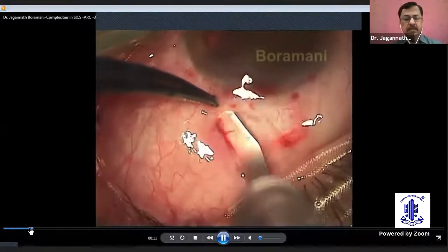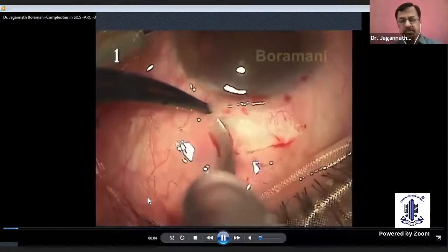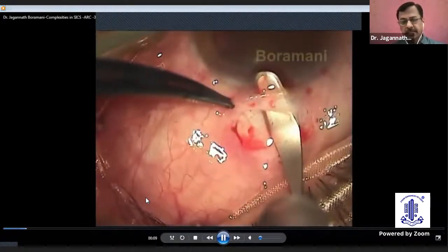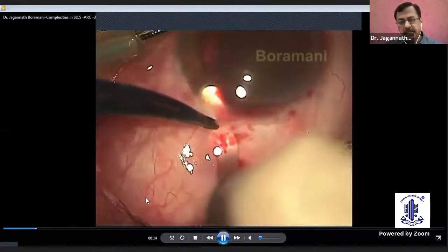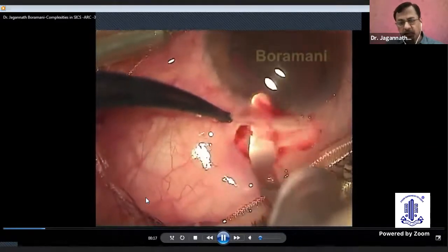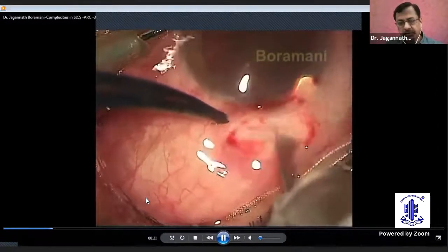Now, basically, if you are not careful when you do the dissection, sometimes there can be scleral buttonholing. Here the scleral buttonholing has taken place. So, every time there is no need to change the site — maybe you start a deeper dissection, go to the left side, and form a new tunnel below the scleral buttonhole site. So you can have a proper tunnel again in the lower area, and this way you can proceed with surgery in such complicated cases.